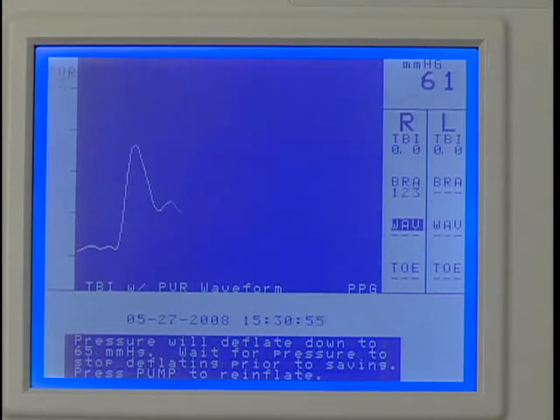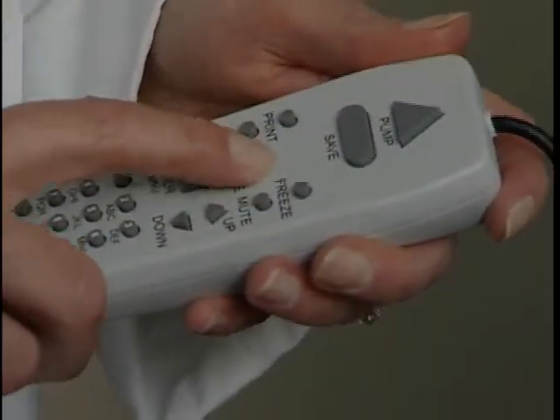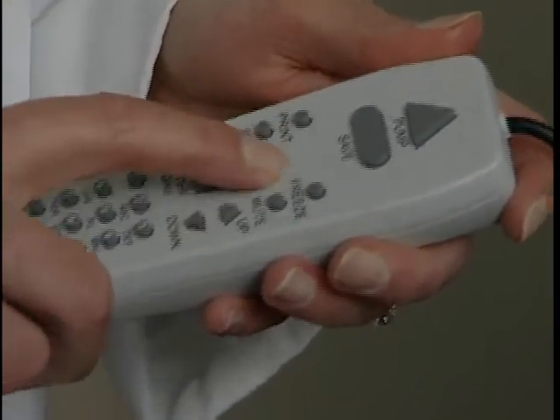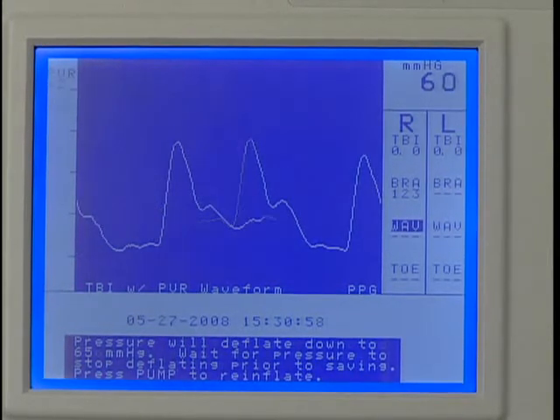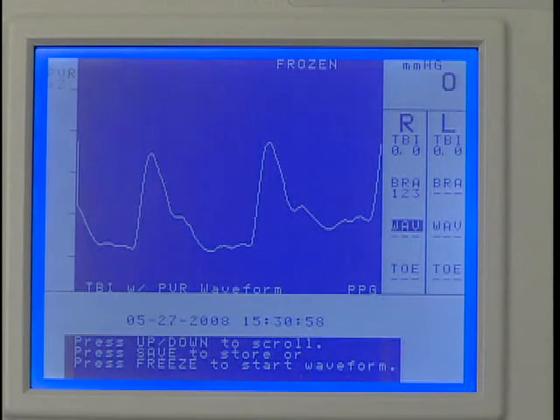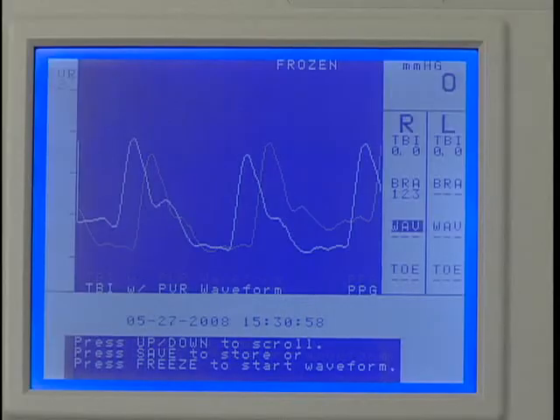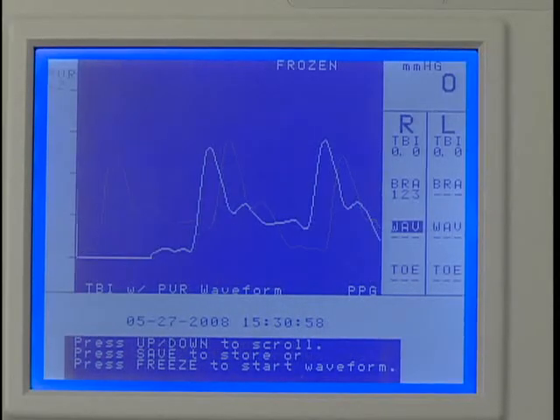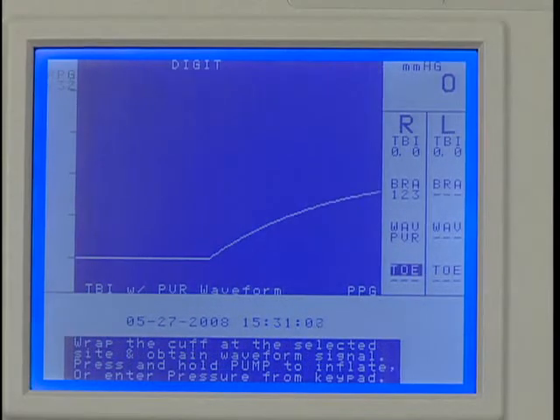Wait for the cuff deflating message on the display to disappear. If needed, use the Scale key to optimize the waveform. After the waveform stabilizes, press Freeze. Here you have two options: if the waveform is acceptable, press Save to record it. Or use the up or down key to scroll to the optimum waveform, then press Save to record it. Press Save again to move to the next protocol location.